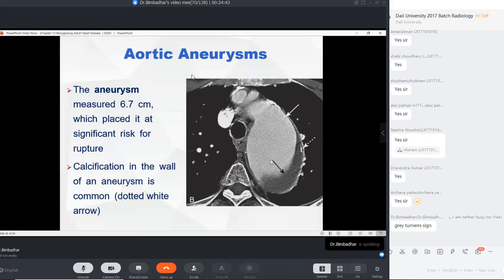Okay, so it is a very simple diagnosis. A big thing like this cannot be called a lung mass. Why? Because I am looking at the mediastinal window and at the soft tissue structures, as the lungs appear blank. If this had been a lung mass, it would not show up like this. It would show up more prominently in the lung window, but the mediastinal window is done for mediastinal structures. So that's the reason I am looking at the blood vessel here.